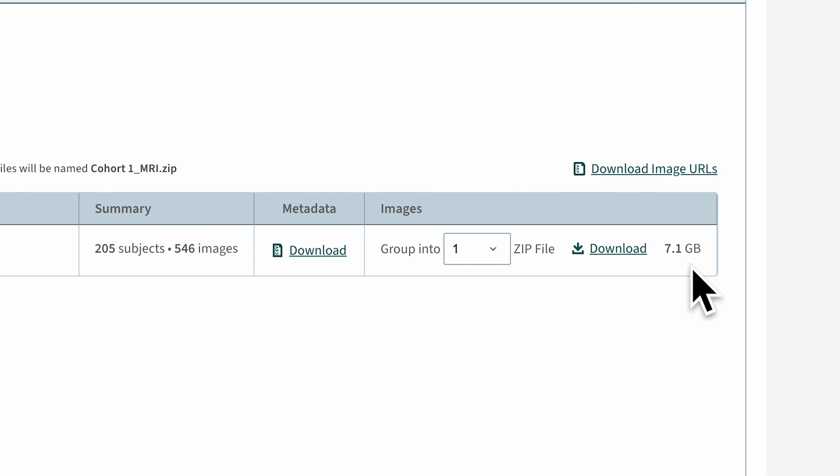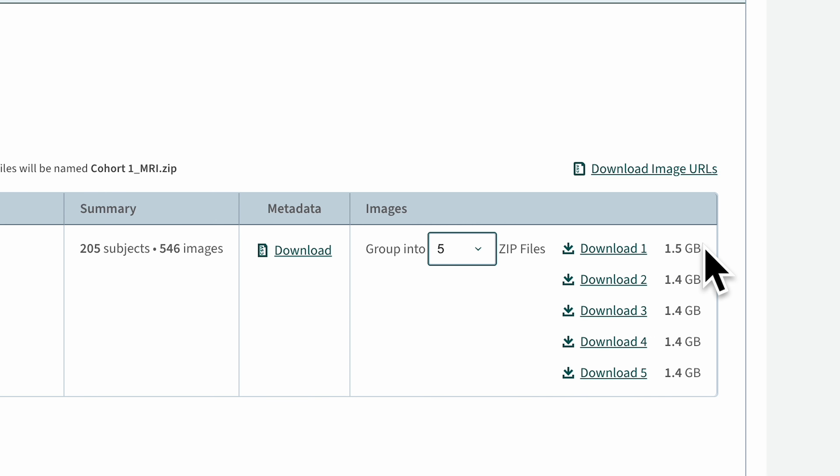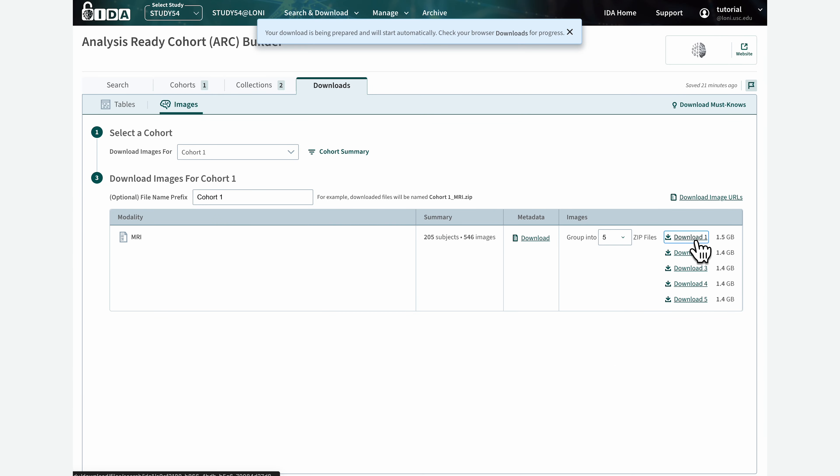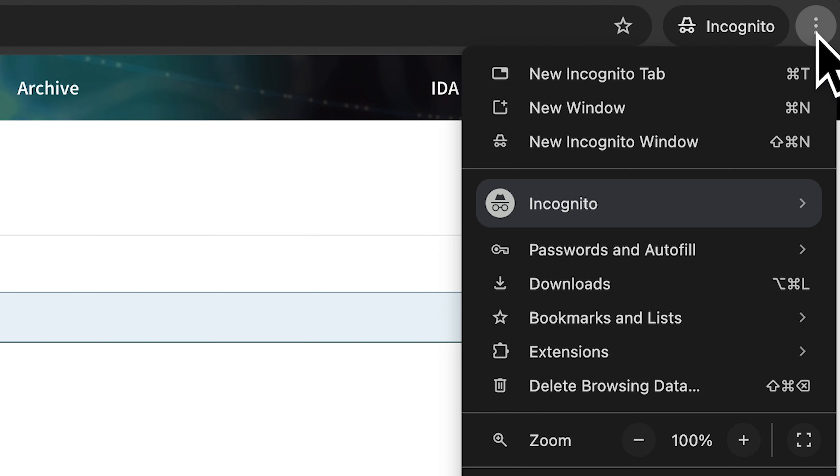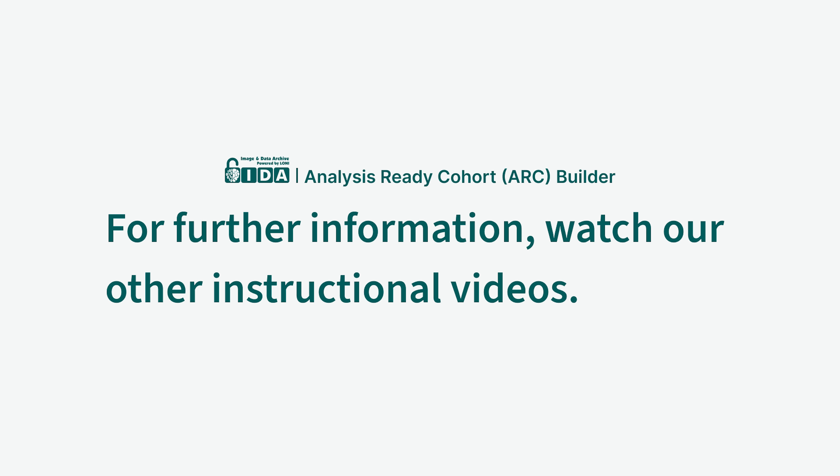If the zip file of the image scans is large, it can be divided into smaller zip files that can be downloaded at the same time. After you click a download link, the download will automatically start in your browser. You can monitor the download progress in the browser's Downloads panel.